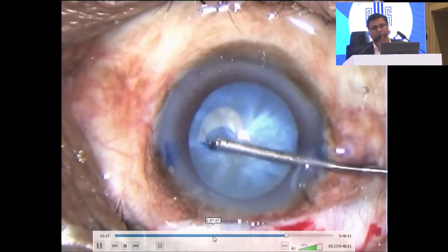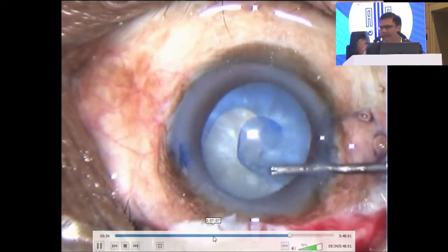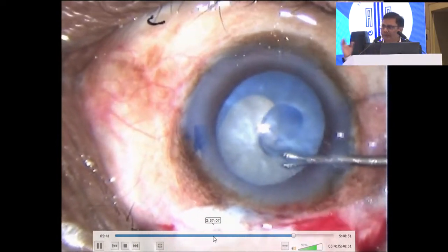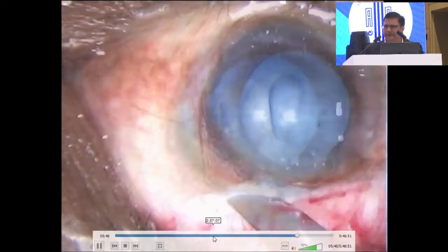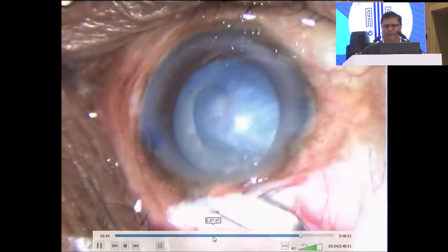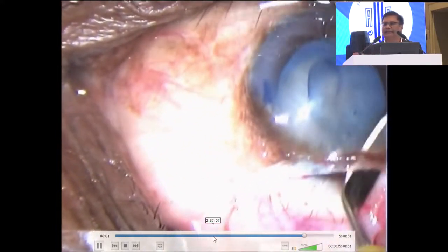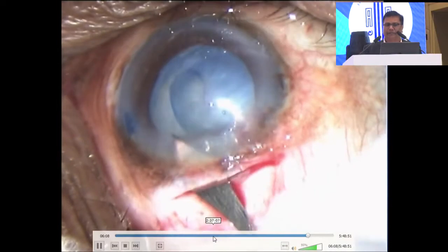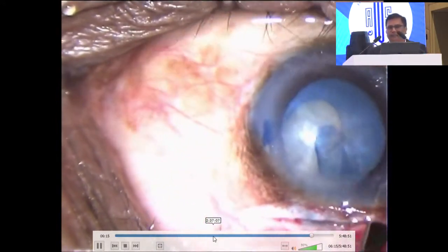This is again one question which I have asked the sir in hard cataract. When you have to shift the case to SICS, so many times if you are not having the best machines which work nicely with the energy, vacuum and flow rate, there is no need to do aggressive things; you have to remove your ego. I am doing it with a limbal incision in many cases of mature cataract, so that I can convert the case very easily, and it is just a routine SICS. What I had decided before, I thought to do phaco, then I have to convert, and in a very simple way, with a simple technique, just shift to the SICS and manage the capsule.